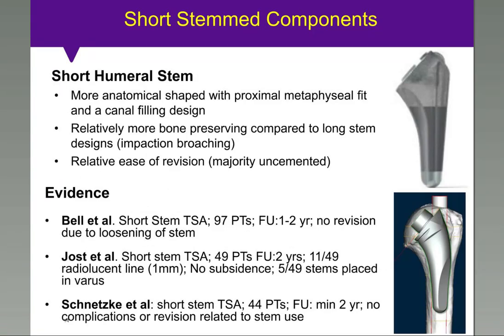Short stem components were introduced to offset some of the limitations that were mentioned with the standard length components. Short stem designs are more anatomically shaped with a proximal metaphyseal fit. They're more bone preserving with relative ease of revision compared to the standard stem. Short-term data with short humeral stems demonstrates clinical and radiographic outcomes that are very comparable to the standard stem.